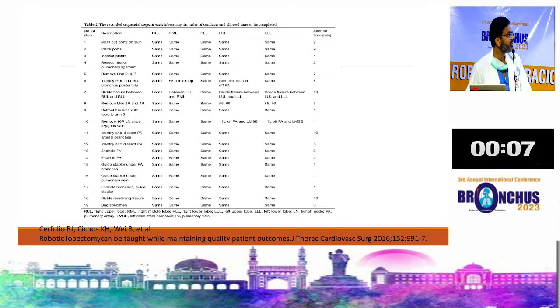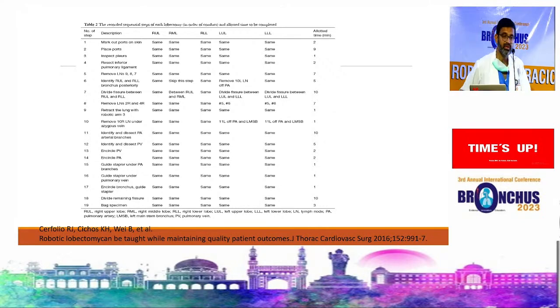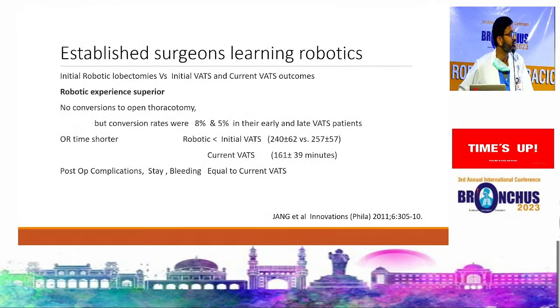And this is the program in which they split the procedure into different steps, and give you the time in which you actually have to perform with a proctor guiding you. Depending upon the step of the procedure, you are given this much time, and then you can actually do that procedure, take that amount of time, probably a little more, little less. These are the targets that you need to set yourself before you progress to do a big, complete procedure.